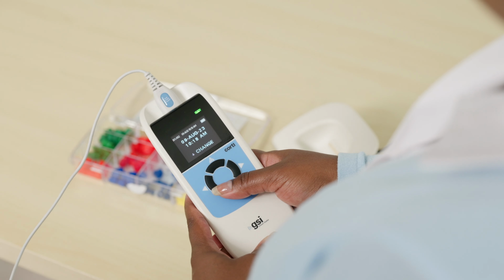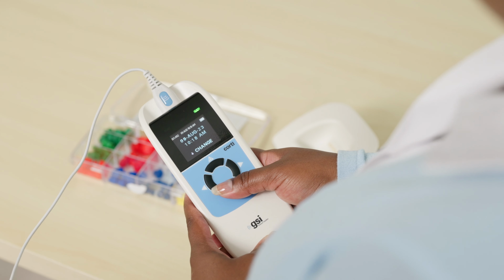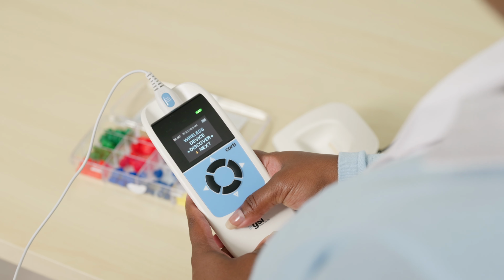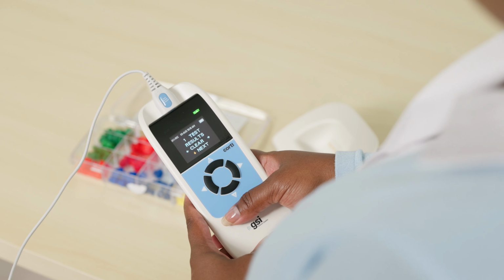To access, press the down button 2 or 3 times until the date and time appears. Then, press and hold the down button for 3 seconds or until the green ready light turns off and release. The wireless printing menu will appear. This indicates that you are in the instrument settings menu.